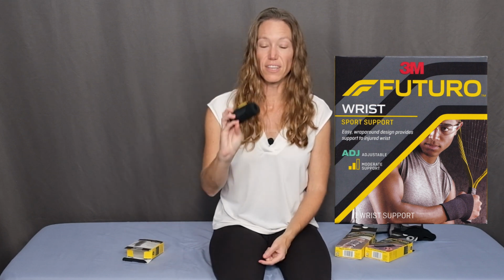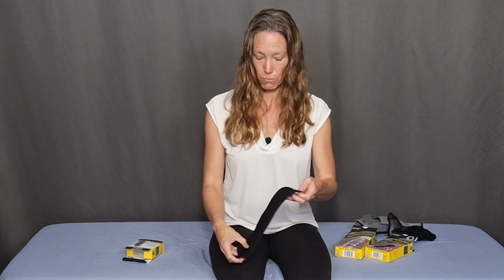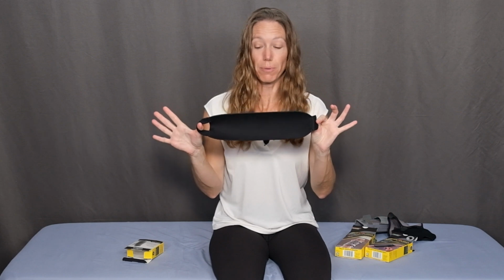This is also obviously a very light fabric. So we'll open the Velcro, and you'll see it's just one strip of fabric.